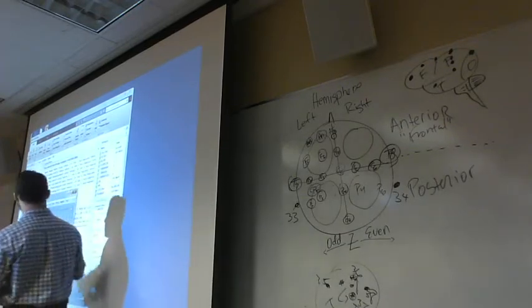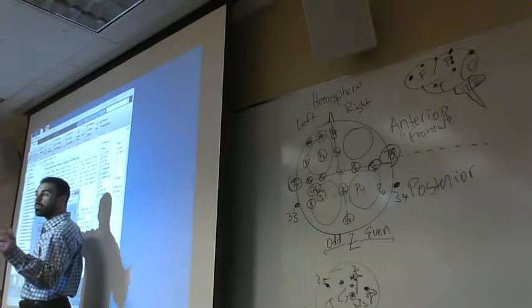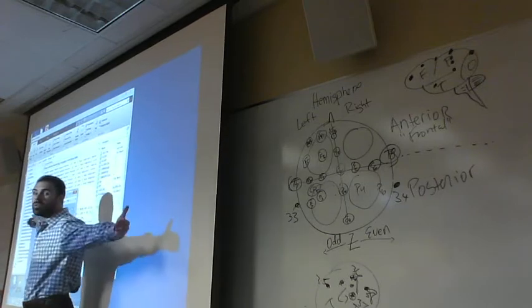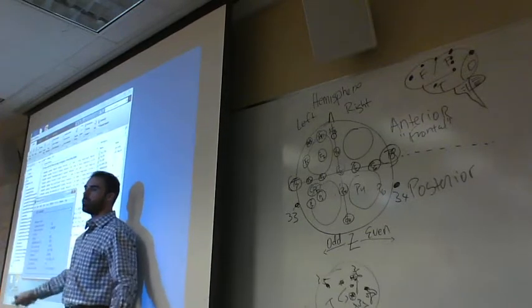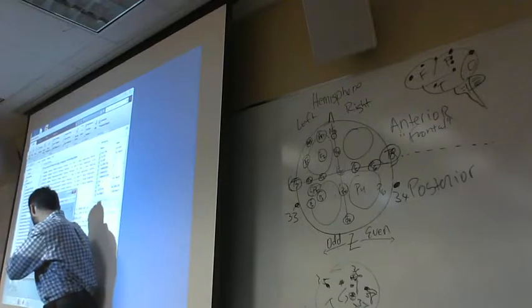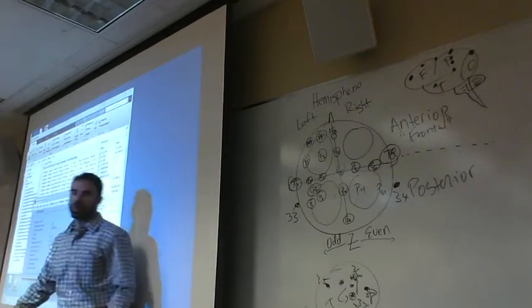So, and again, it tells us how many channels we have. We have 38. We've lost the other 2 of our re-reference ones. We have 1 epoch because it's 1 long piece of EEG. Our sampling rate is 1024. We're going to lower that because it makes for a much larger size sample than we need. It tells us our reference sites of the left mastoid and the right mastoid. Okay, so we have all that information.